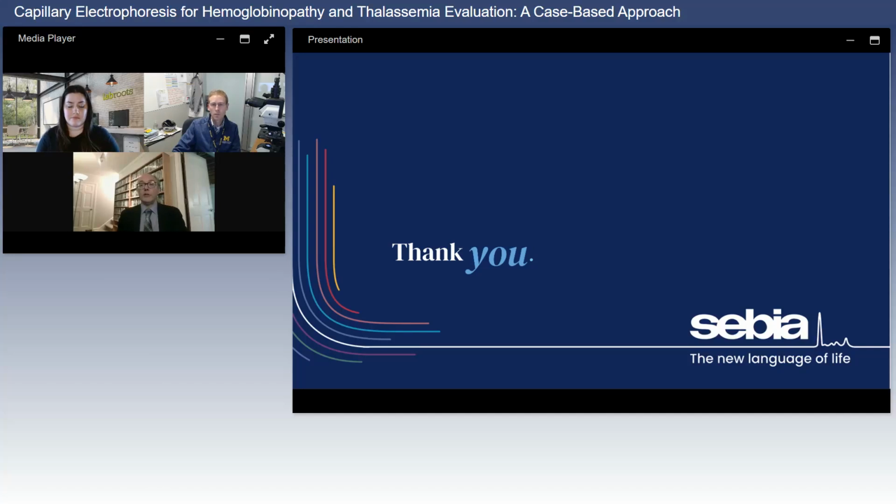So measuring hemoglobin D and hemoglobin E, both of these are straightforward. They both have individual zones on the capillary electrophoretic pattern, and in isolation, if it is a D trait or an E trait, you're going to be able to quantify those just as readily as you would quantify a hemoglobin S trait. Of course, you would need to confirm that it is hemoglobin D or E with a secondary technique.